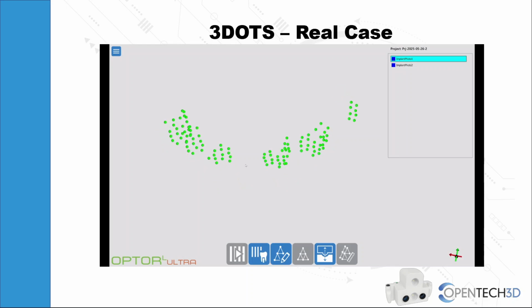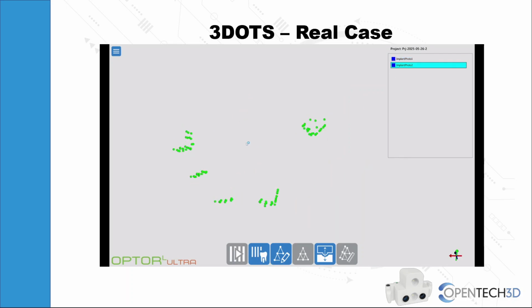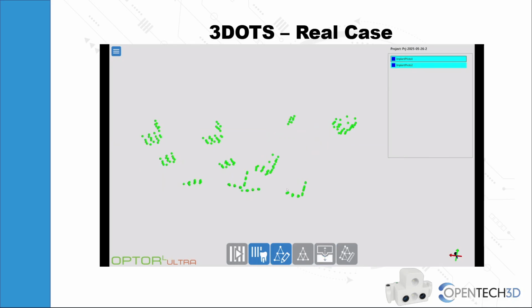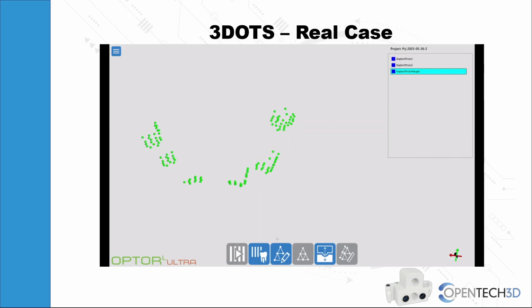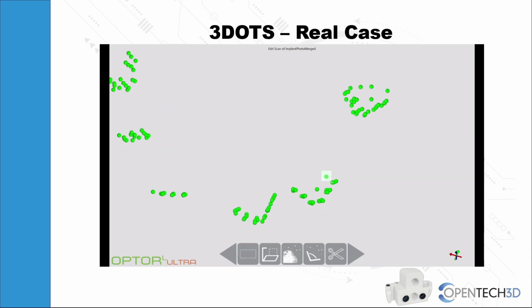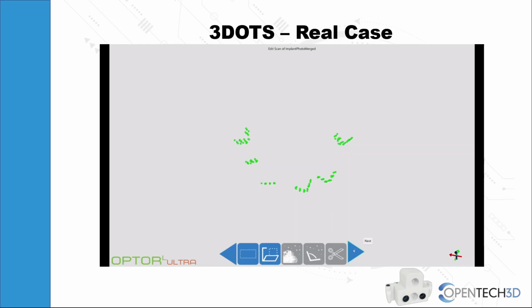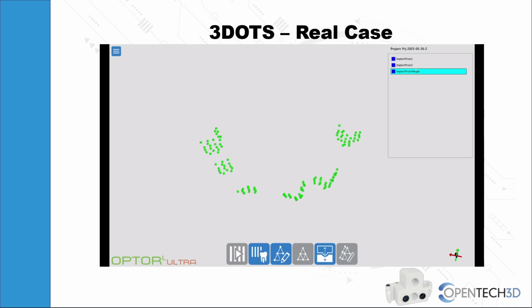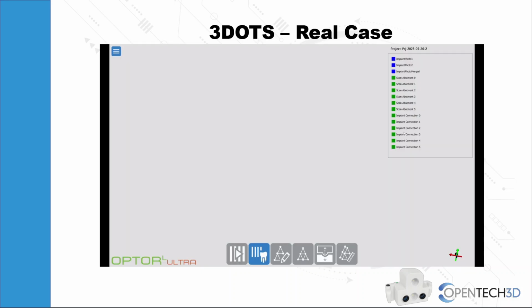Let's also see how the scan is managed within the software. As one scan abutment covered another, we scanned twice. In the second acquisition, we removed the scan abutment that covered the other. So we have 2 groups of scans, one where we have 6 scan abutments, but one is partial, the other where we have 5 because we removed one. The software allows us to align them simply with a click. We obtain a merged scan of the 2, where we have all 6 scan abutments. We clean it, which is an option given by the software. And we do what we did in the previous example on the model. We find the position of the 6 implants. By associating the library, in a very short time, we have the 6 implant connections positioned with photogrammetry.